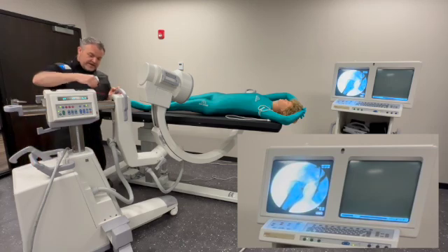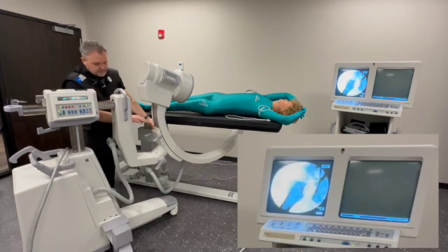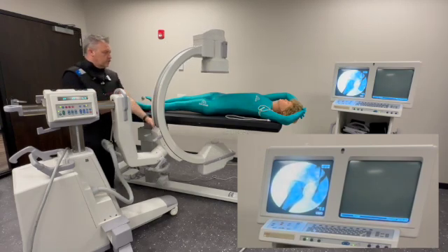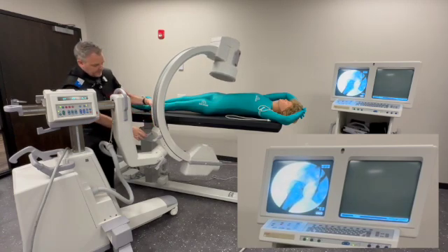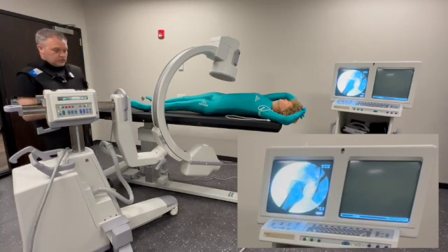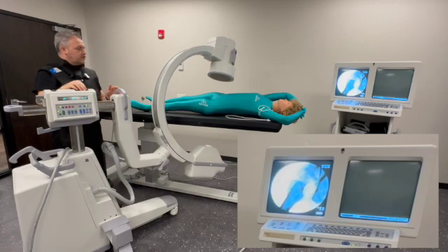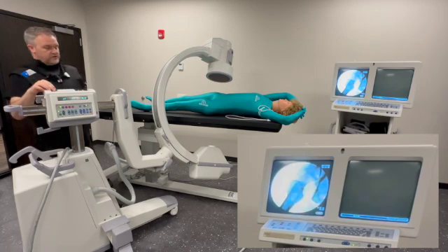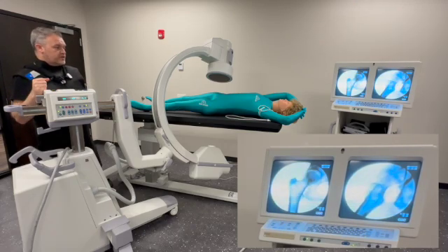Now when I come up to the AP, I am about 17 degrees from lateral. So to get my lateral femur, I'm set at 17 degrees. To get my AP, I have to add 90 degrees to that — so 90 plus 17. When I'm arced this way I'm rolling too far over the top, so to get that plane I'm shooting across the patient. I have to tilt my C-arm so that I can give a trajectory back at 90 degrees to the body, which is where I want that central ray approaching the patient. Let's go ahead and take that image — there's our AP, which gave me 90 degrees.